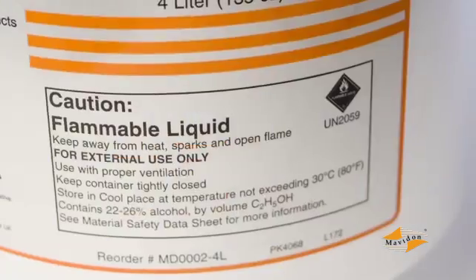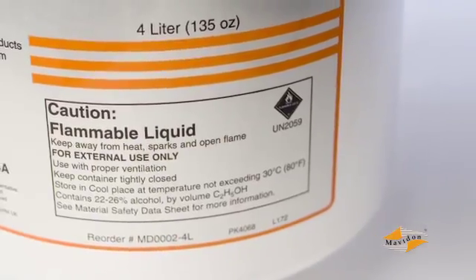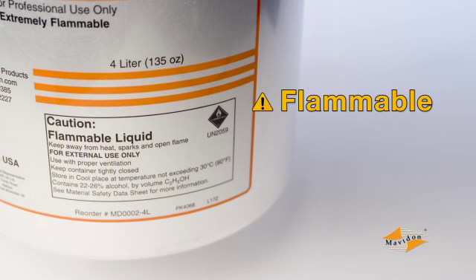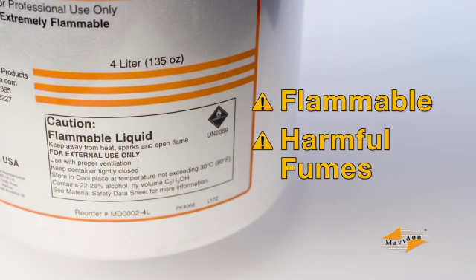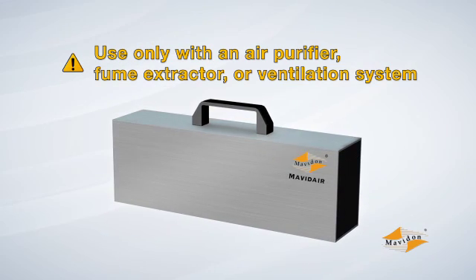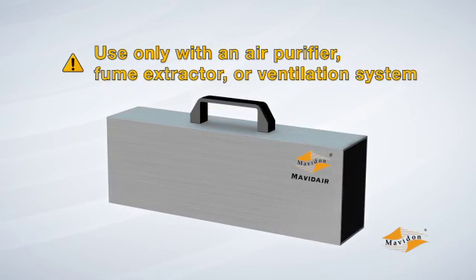Like any chemical, certain considerations should be taken with the use of collodion. Collodion is extremely flammable and can release harmful fumes. Proper care must be taken to ensure the material is used and stored safely, and it should be used only in an area with an appropriate air purifier, fume extractor, or ventilation system.